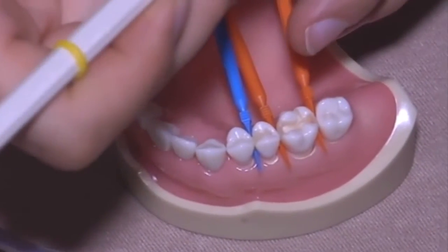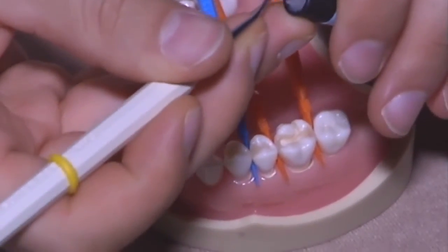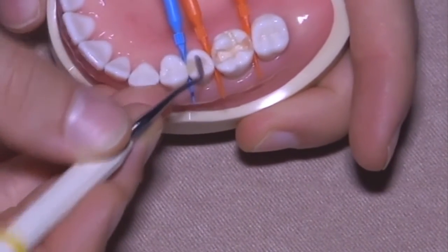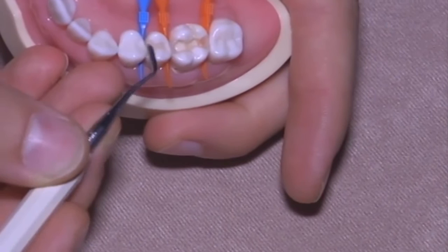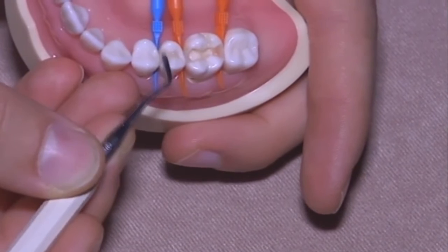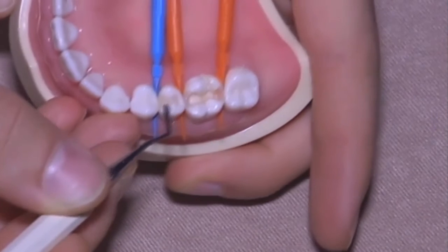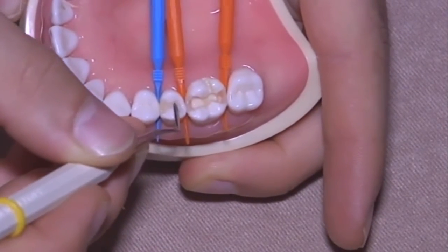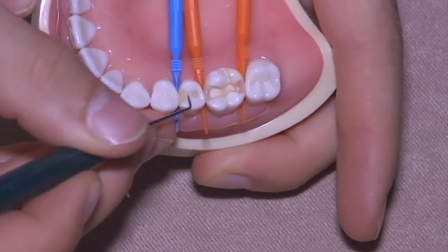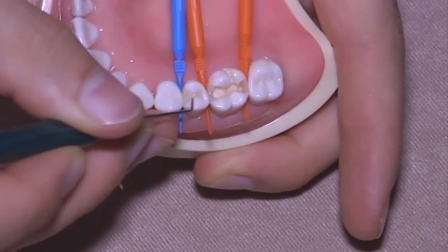A little bit of composite is missing. Once you get the adaptation on the floor, you have to remove slowly the excess, following the residual crest.